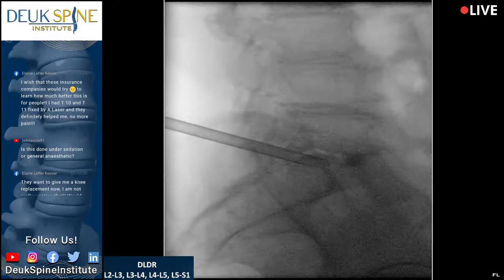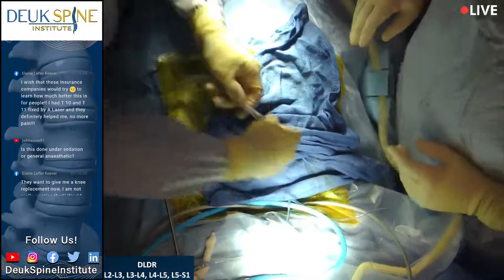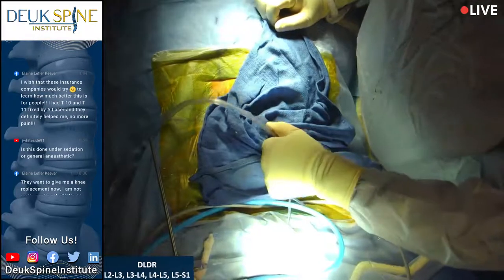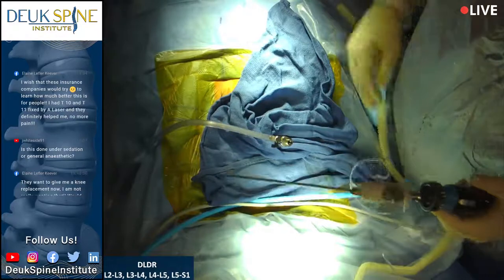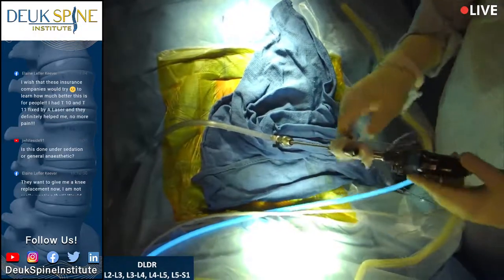Last disc. Now remember, this patient's actually going to be back on Thursday, 2 days from now, for his right side. Normally we don't need to do both sides for back pain, but we need to do both sides for leg pain. So this patient has equal neurogenic claudication on both sides. So this surgery today will fix his left leg symptoms and his back pain, but it won't fix his right leg symptoms. So he wants both legs treated. That's why he's staying here for the whole week and getting it done.